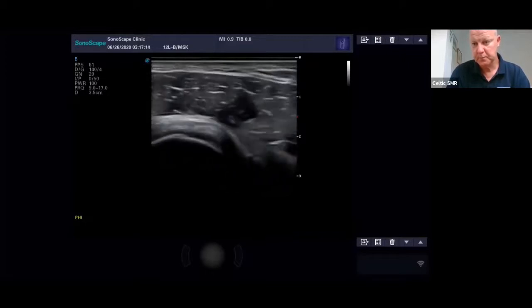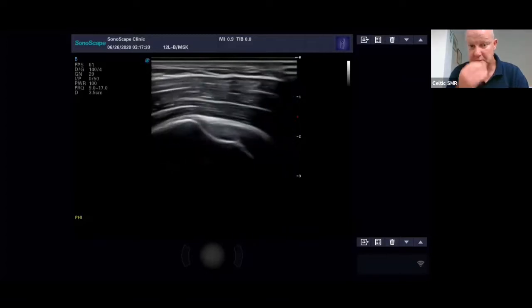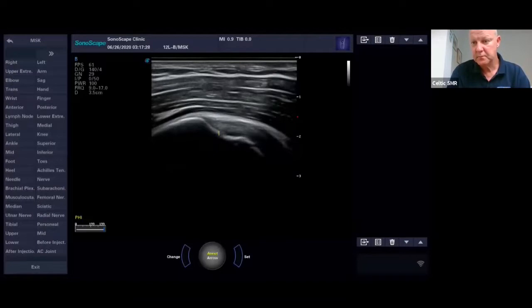Now, from this point, I can go longitudinal, and therefore I've got the supraspinatus in long section. If I just freeze that, this is now supraspinatus. This is the superior facet. This is the deltoid, and obviously subcutaneous fat and skin at the top there.